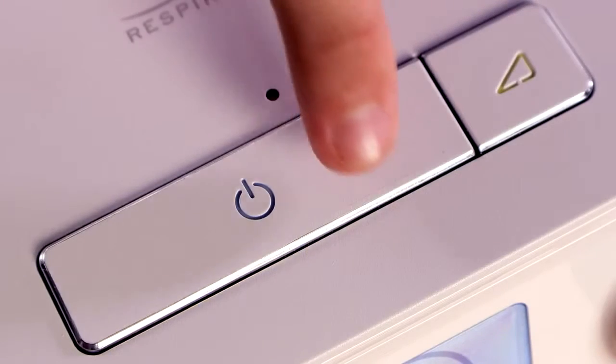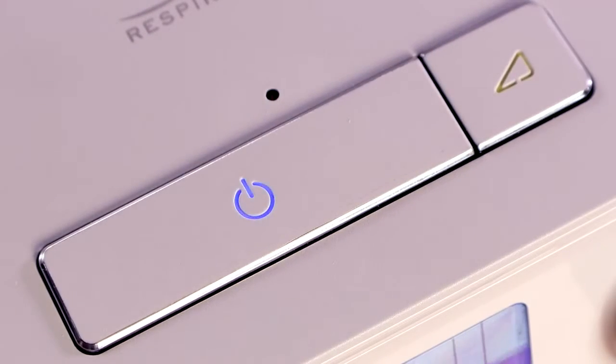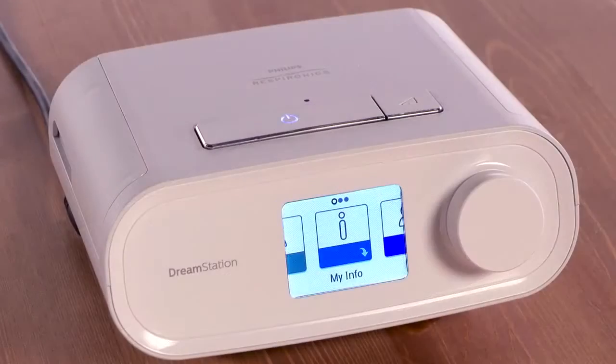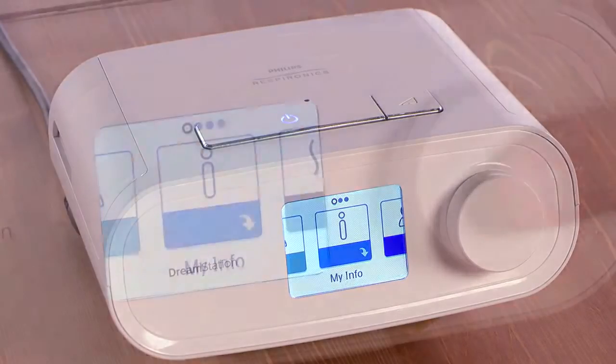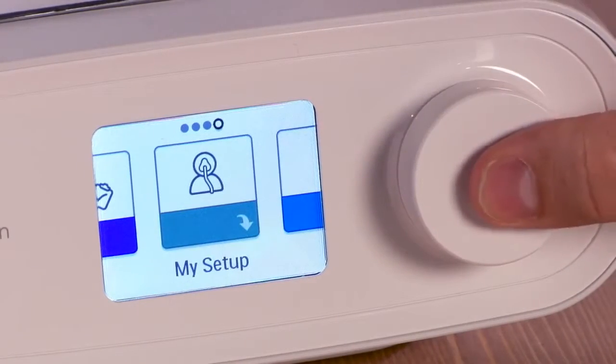In the morning, when you are finished with your therapy, press the on-off button. With therapy turned off, you can make adjustments to your ramp starting pressure in My Setup.